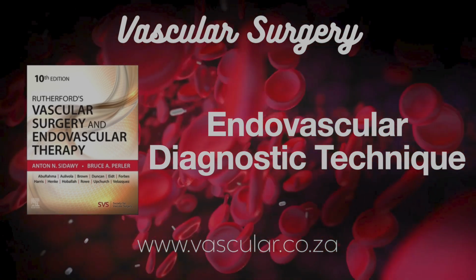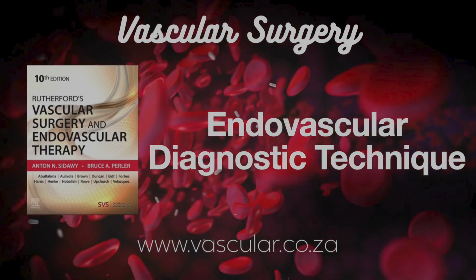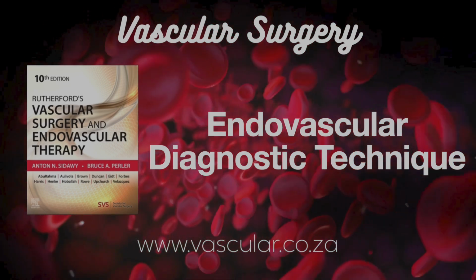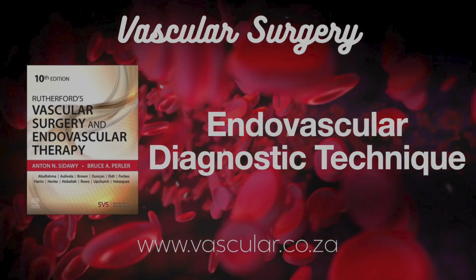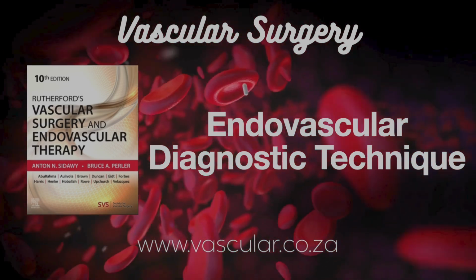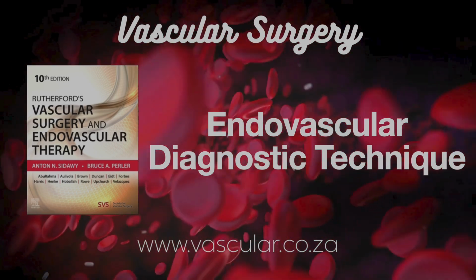How much contrast? A standard injection might be, say, 15 mL per second of 50% contrast for a total of 30 mL. Using a power injector, maybe around 800 psi pressure. What if you need to see higher up, the thoracic aorta? Need a longer catheter, obviously. And for specific things like planning an aortic endograft, you might use a special marker pigtail catheter with measured marks on it for accurate sizing.